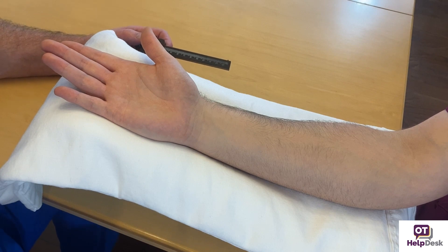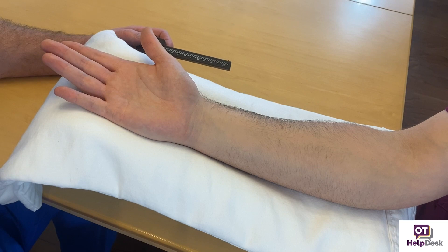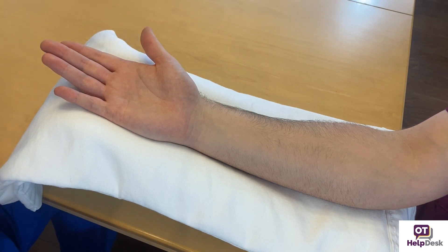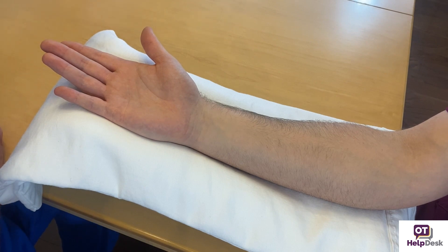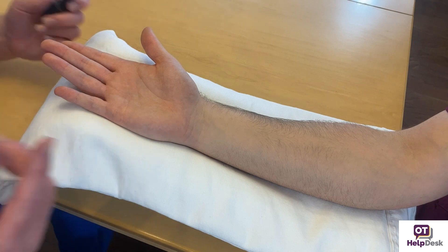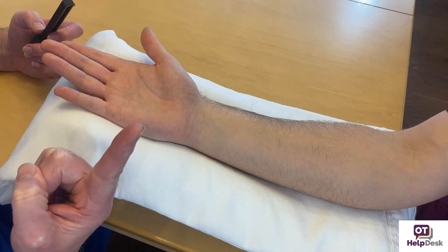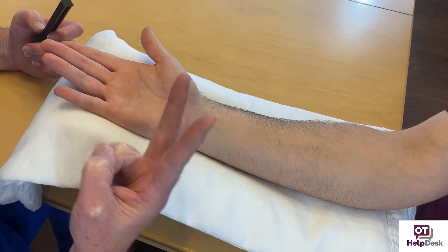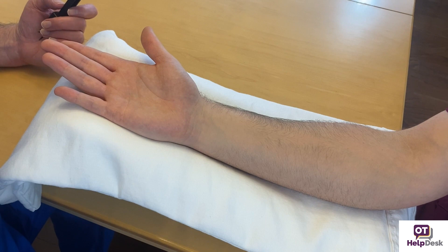For the procedure, you're looking at 10 applications. For a normal or accurate response, you need at least seven out of ten. The possible responses are: one point, two points, or 'I don't know' / 'I don't feel it.' Seven out of ten is considered accurate.